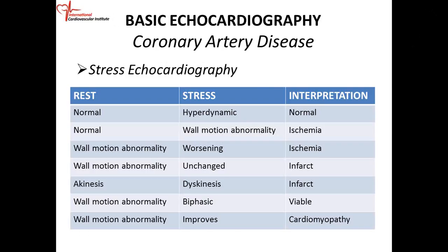You also need to do blood pressures periodically during the stress test. You need to do blood pressure at every stage. So usually a good rule of thumb is to get your blood pressure 2 minutes into the stage. 2 minutes into each stage. Again, you're going to talk to the patient, see if they're having any symptoms. You're going to look at the ECG, see if the ECG changes.